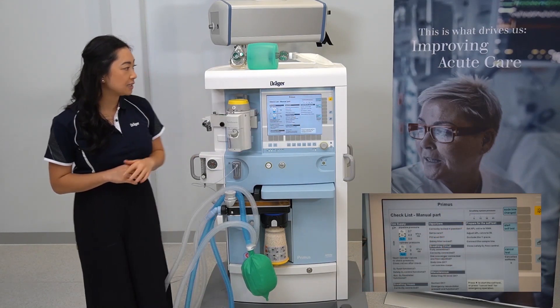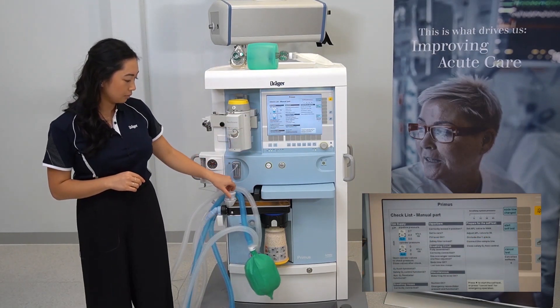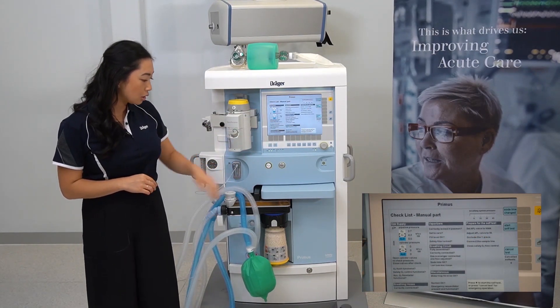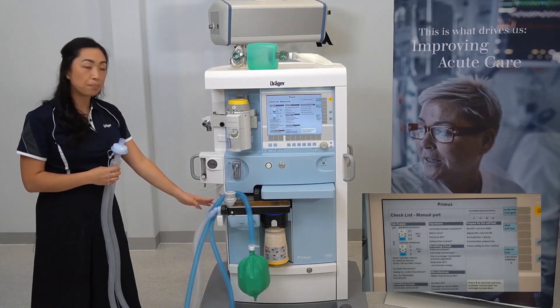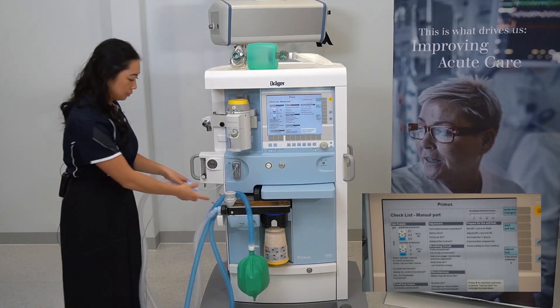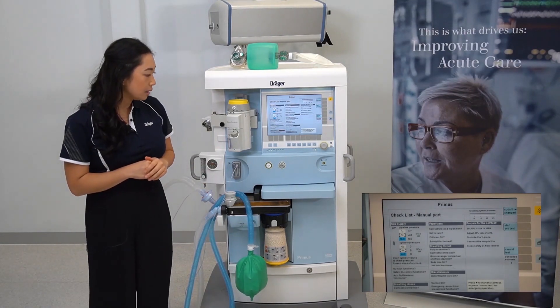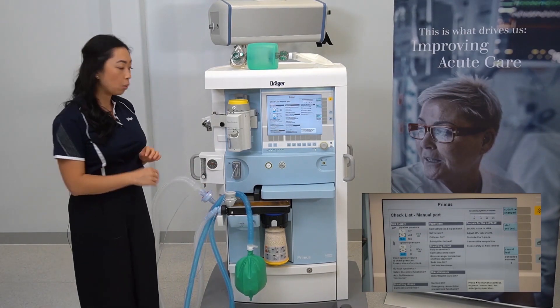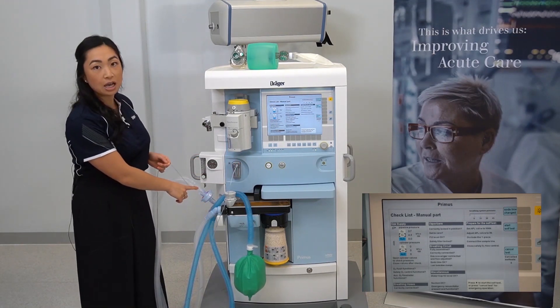To prepare for the self-test, set the APL valve to 30, occlude the Y-piece of the breathing circuit to the notch on the bag port, and connect your sample line ensuring one end is connected to the water trap and the other end to the machine side of the filter.